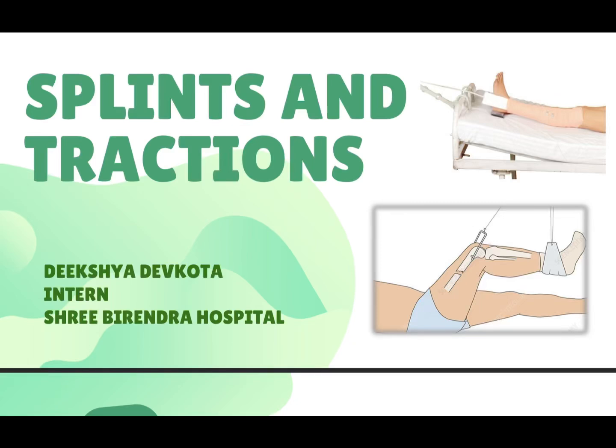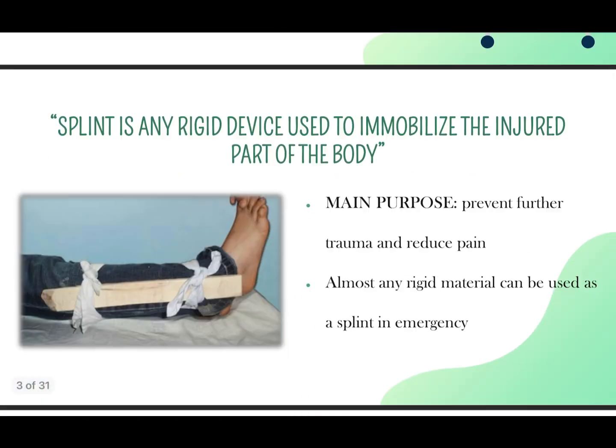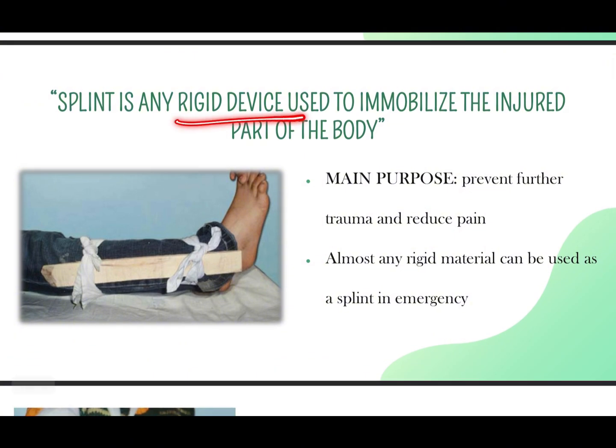Hello everyone. So today we will be talking about splints and traction. Splints and traction are a very important part of day-to-day orthopedic practice. First, let's start with splints. A splint is basically any rigid device which is used to immobilize the injured part of the body.